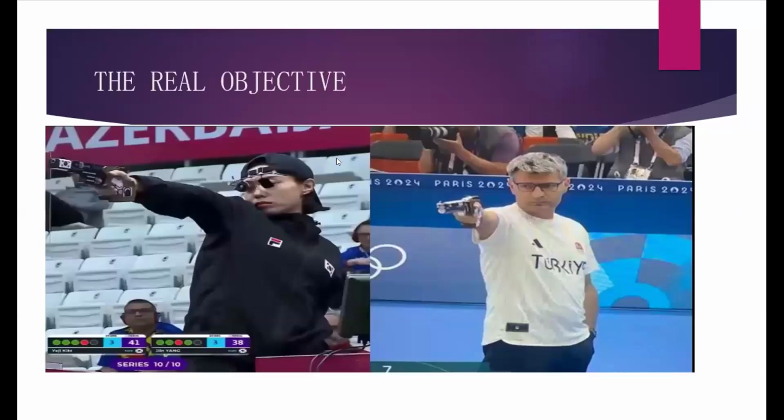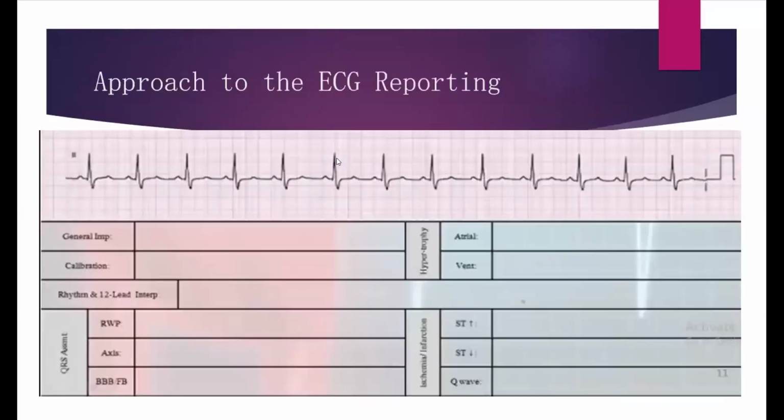So without further ado, these are the objectives. And we'll still look, for a few seconds, at the slide for reporting ECGs. We'll look at tachyarrhythmias, T-wave abnormalities, and ST abnormalities. As always, the objective is to make you a quasi-expert into an expert in ECGs. So this is how to report the ECGs like we talked about last time.